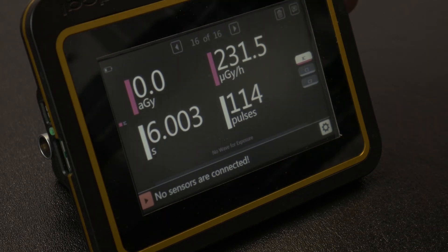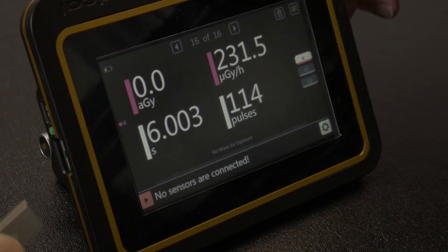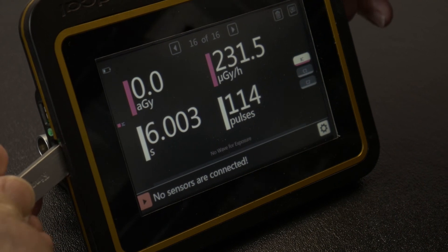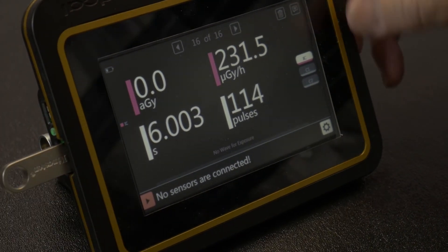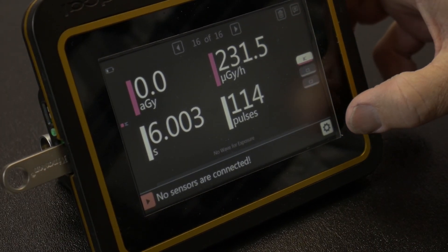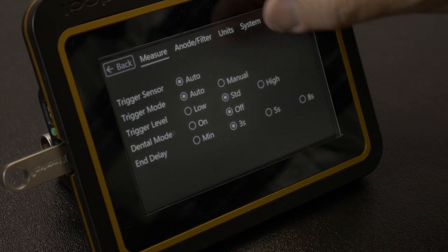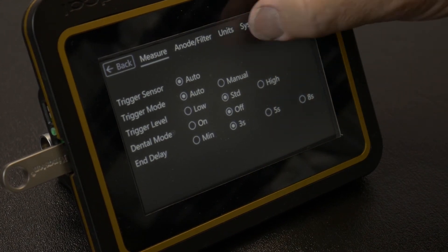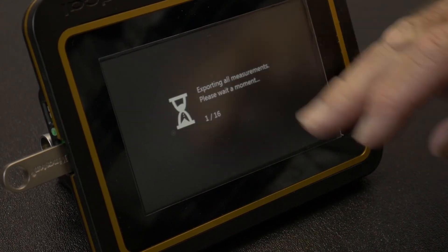Start by connecting a flash drive to the USB 2 port, then go into settings options. Wait a couple seconds for the drive to be recognized, select the system tab, then press export to USB.